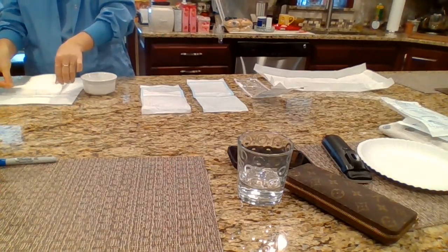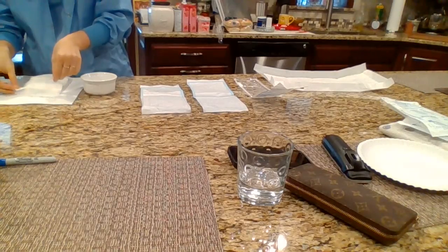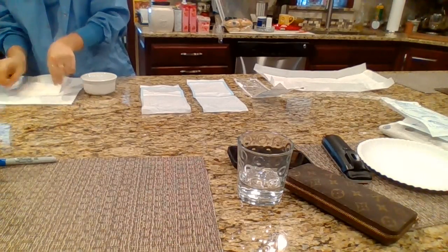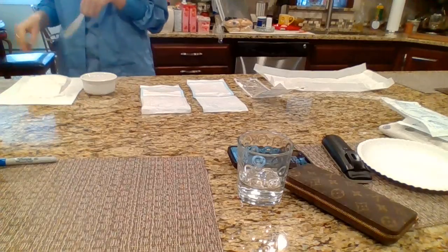How you can do this, you can kind of just set it over top of the ABD pad, just to get a good measurement so you don't make the tape too short. And you'd want to do this on all 4 edges.